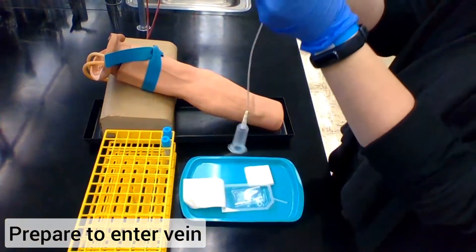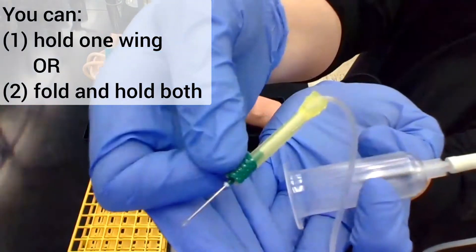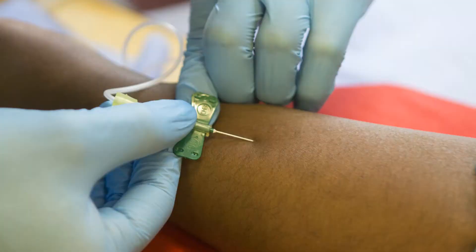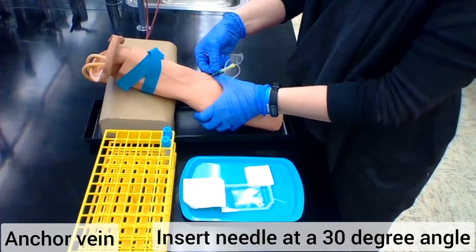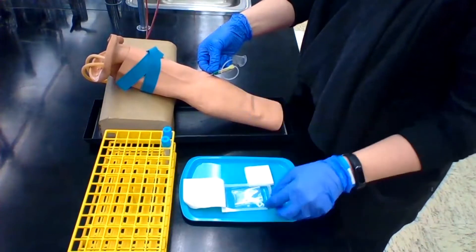Shift the needle to the hold that you are going to use to insert it into the vein. I personally like to fold over one wing and hold them both at the same time, but you can also just hold one of the butterfly wings at a time. Go ahead and anchor that vein just like you usually would and enter into the vein at a 30 degree angle.